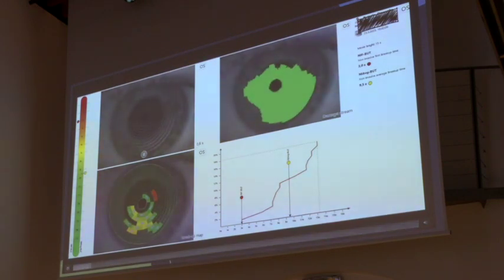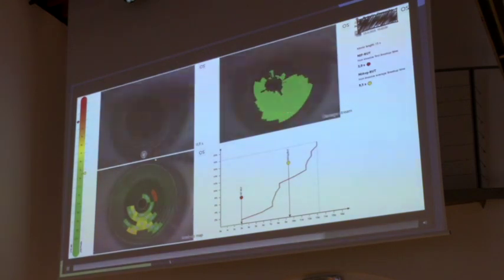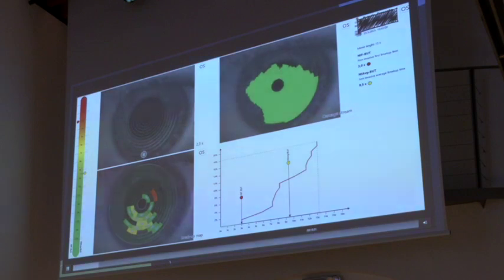So I turn on Phoenix on my computer, and I turn this on for the patient who has a problem. And I show them, see this? See how your tear film is breaking? See what is causing problems? And then we make a decision together. Hey, based on your bad tear film, do you think that you would be willing to first undergo treatment for dry eye? Or do you think that you would rather have the surgery now and then deal with this problem later? But it's a shared decision.